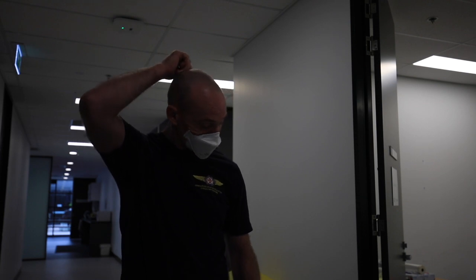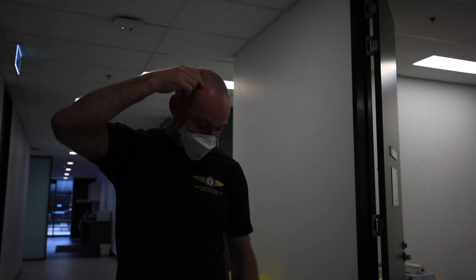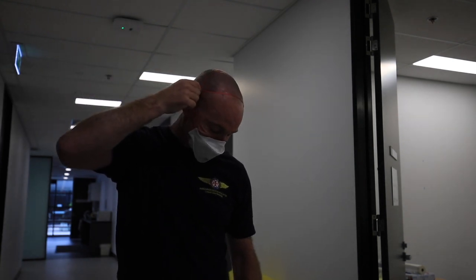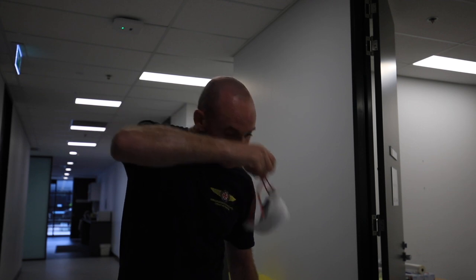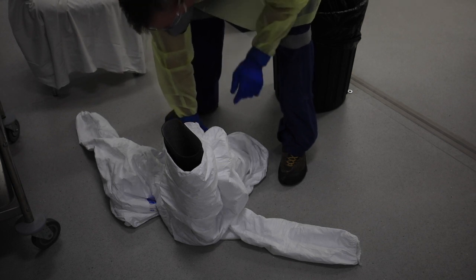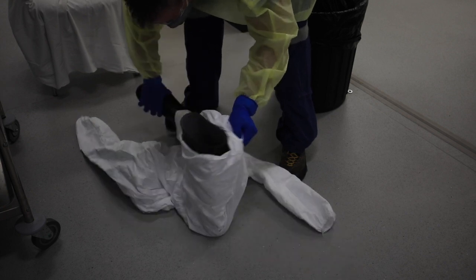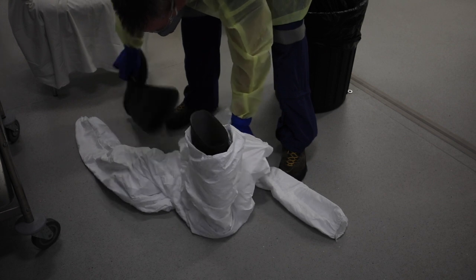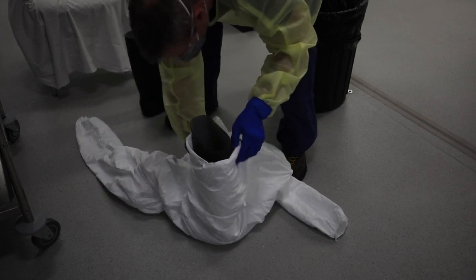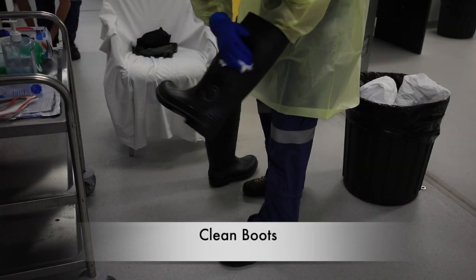Now I'm removing my P2 mask. Being the orange person in the anti-room, these boots are recyclable, so secure the clean part of the Tyvek suit, grab the boots and remove them from the Tyvek suit, then put the Tyvek suit into the bin and give the boots a wipe down.